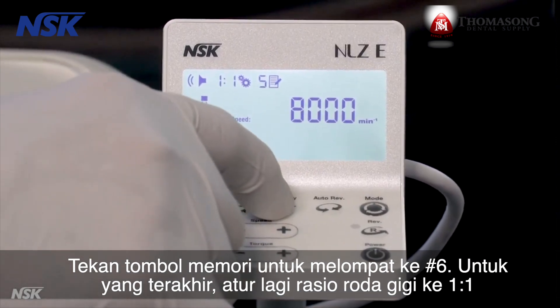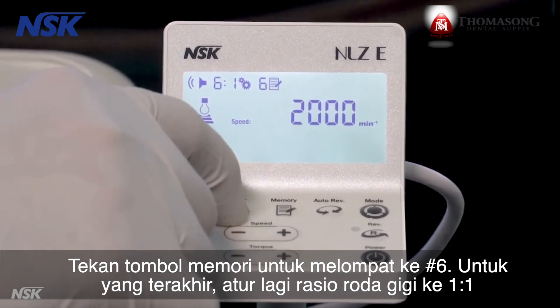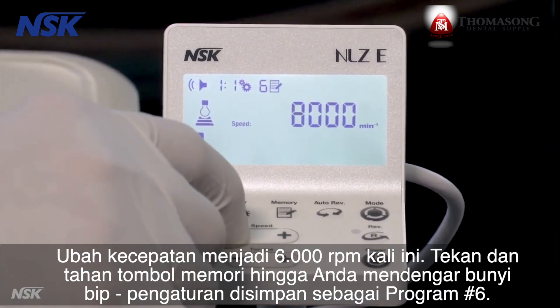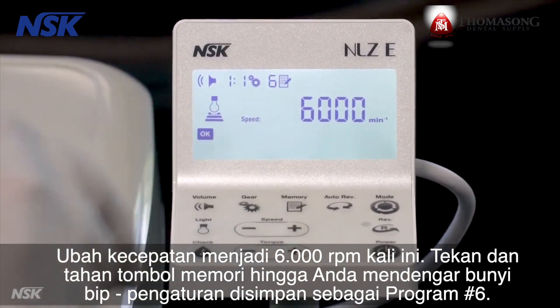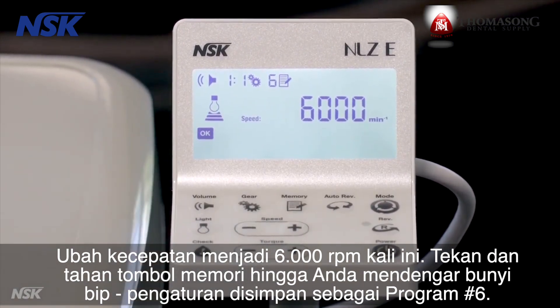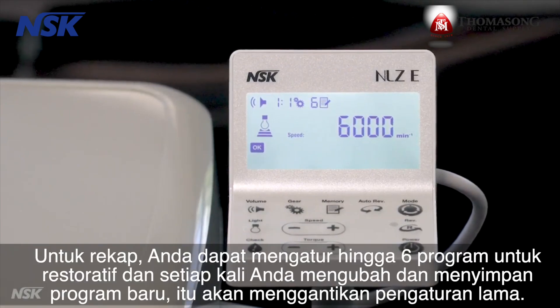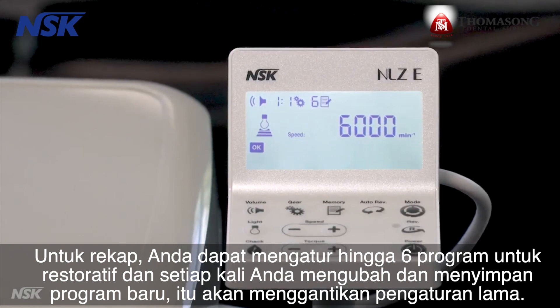Press the memory button to jump to program number six. Set the gear ratio to one to one and change the speed to 6,000 RPM. Press and hold the memory button until you hear a beep — the setting is stored as program number six. To recap, you can set up to six programs for restorative, and any time you change and store a new program, it will replace the old settings. This is similar to setting a radio station in a car.